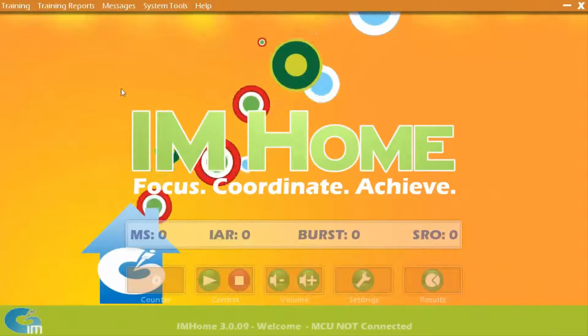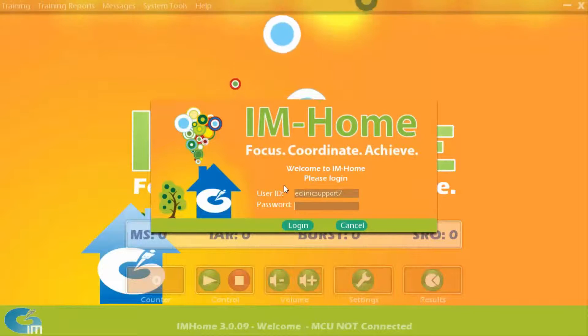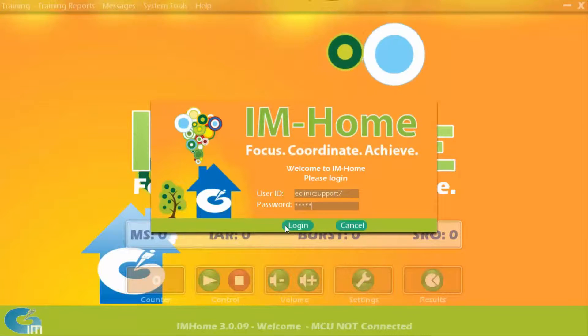Now return to the I Am Home software screen. Click the training menu link, re-enter your username and password, and the member training plan will be downloaded to the client computer. They are now ready to begin their training.